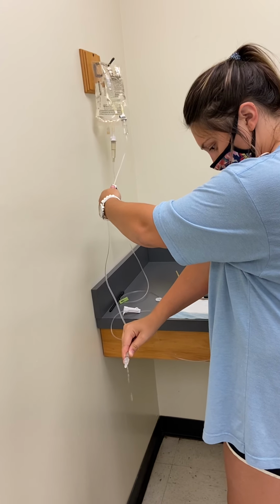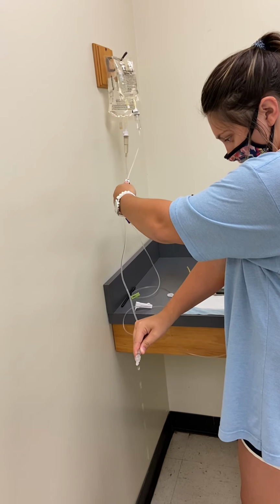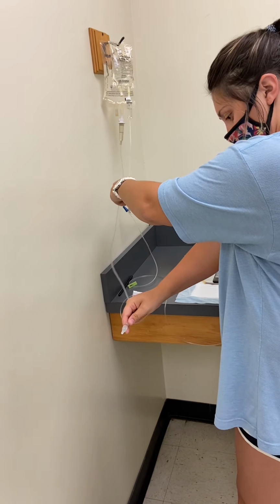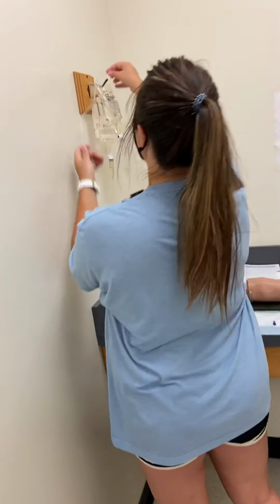Getting all my air bubbles out. There's one more coming. Alright. And now I'm ready to go to my patient's room.